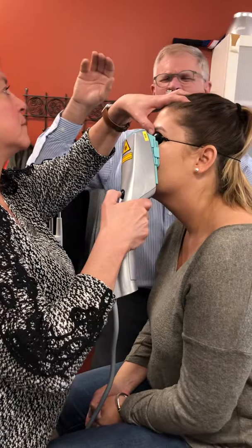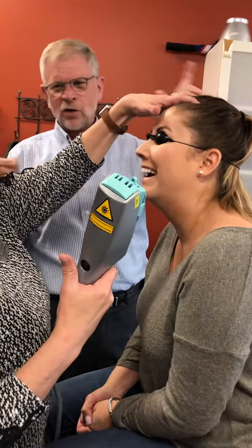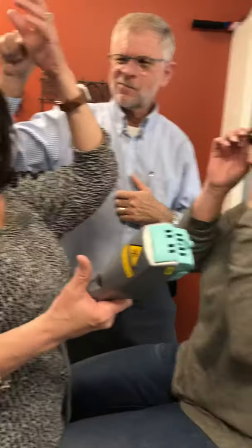Don't look at it. You don't have to look completely away, just don't look into the light. But I look at it. In your case, when you're treating, you should have the glasses on. You can see it on someone else in a second.